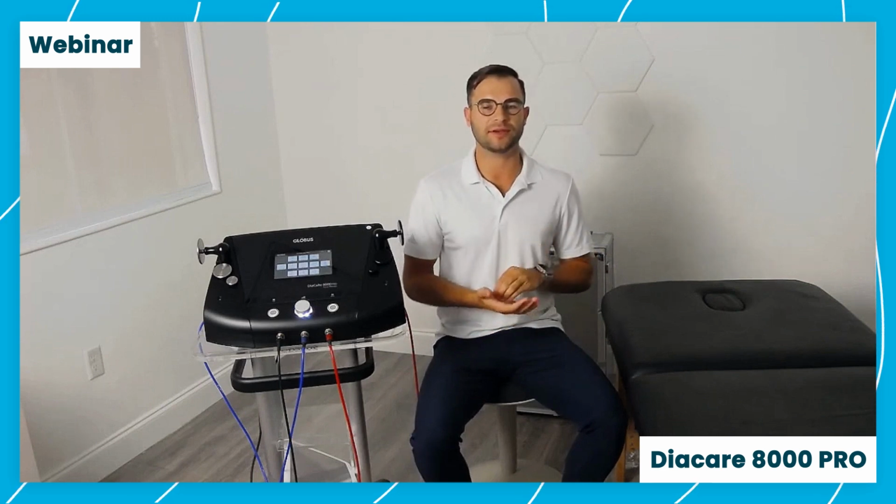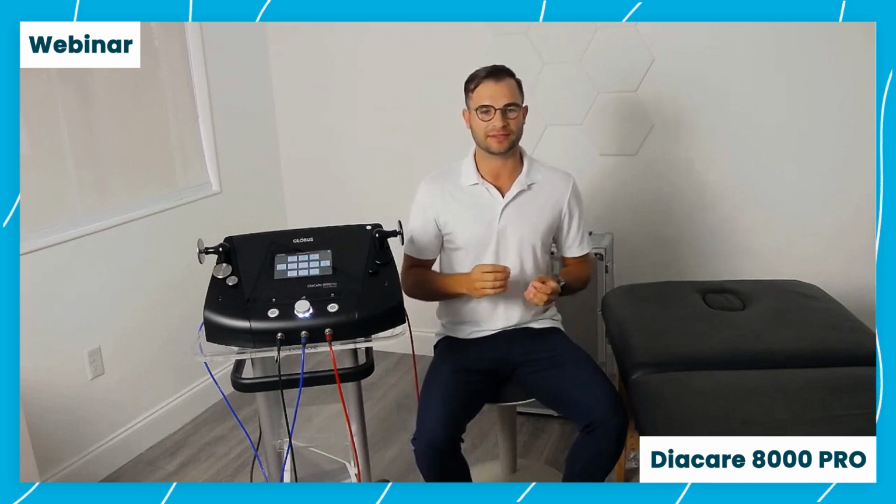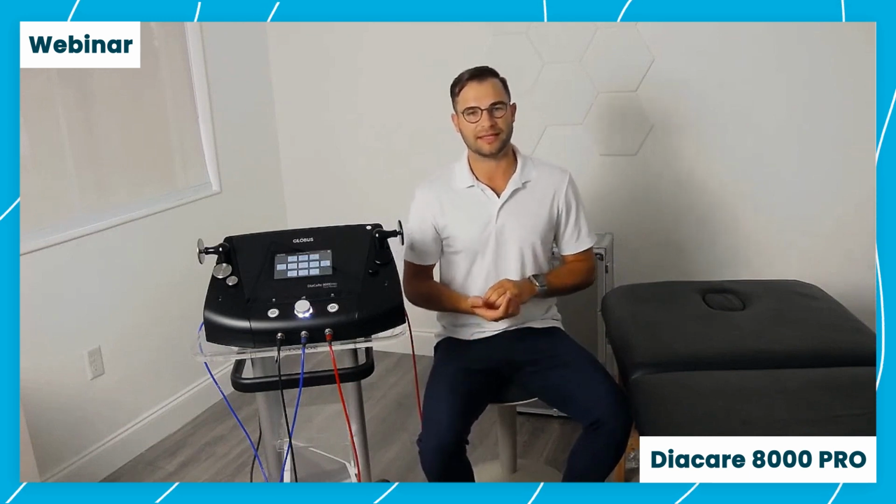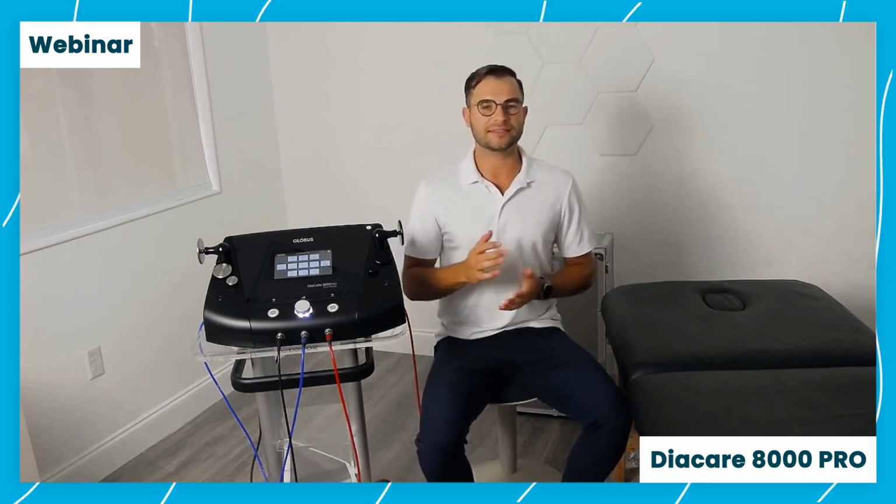If we keep moving on, we're going to be back to frequencies. We talked about this a little bit already. However, it's very important when doing Diacare therapy to consider each frequency for your treatment. The Diacare 8000 Pro has 6 different frequencies that we can use. Each one is going to be slightly different. A lot of people talk about Diacare therapy and they say the lower the frequency, the deeper it goes. It's a good way to look at it, but it's not necessarily 100% true.